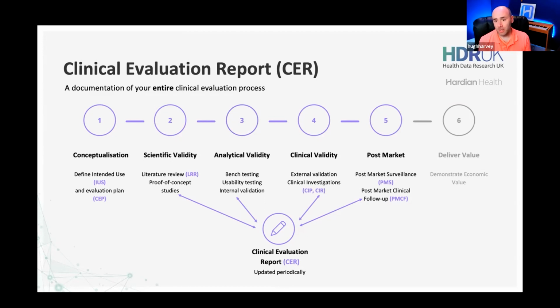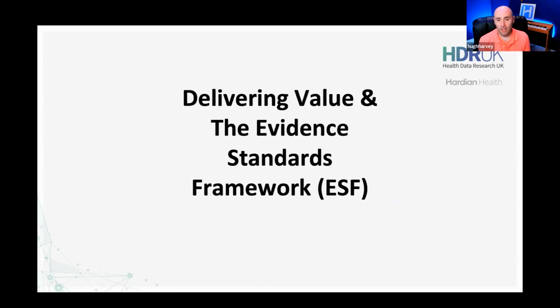So we're going to move now on to step 6, which is delivering value. And we're going to reference this in particular to the new NICE evidence standards framework, herein referred to as the ESF. So for those of you who don't know, NICE is sort of an arm's length government body in the UK, the National Institute for Healthcare Excellence. I can't remember the acronym exactly, but NICE is the non-regulatory body for all clinical drugs, devices in healthcare. And obviously, software as a medical device is a new subset of that.